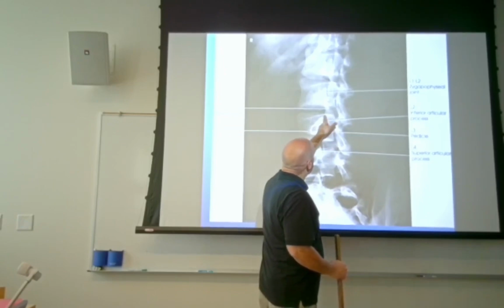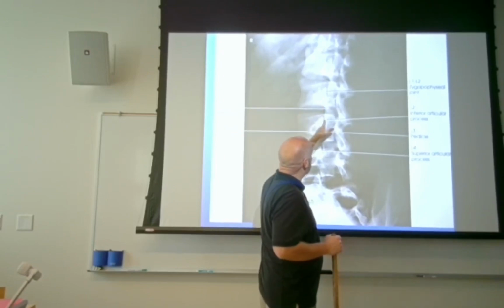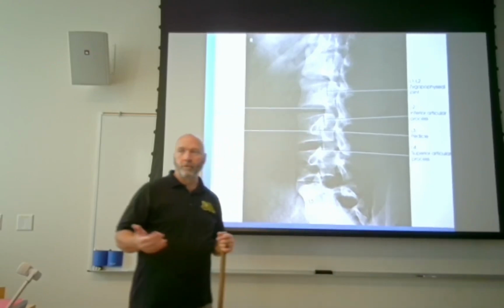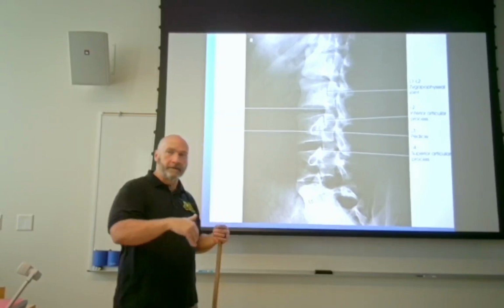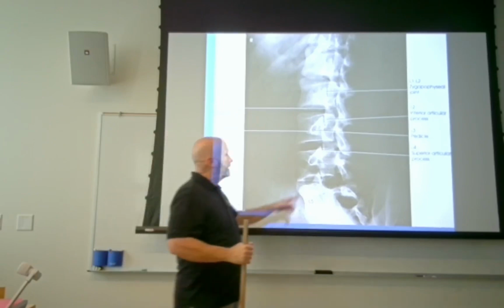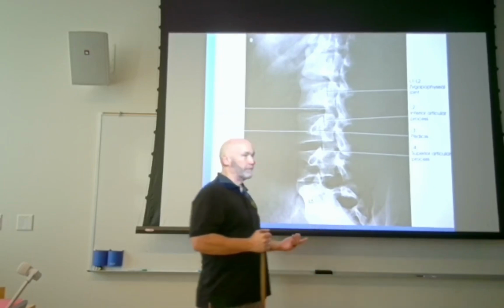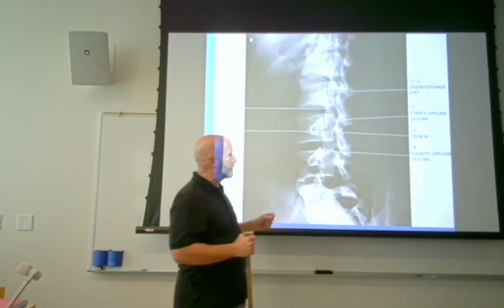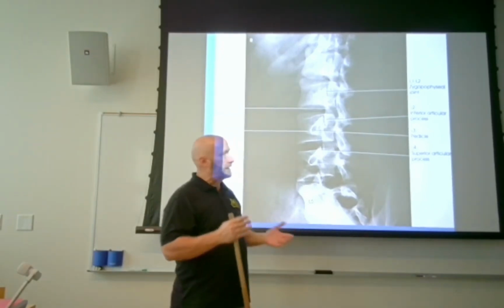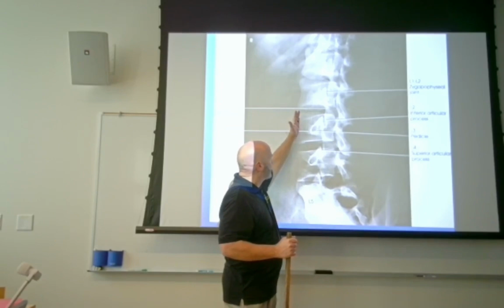But look what happens with the ear and the leg of this Scotty dog. You can kind of see that gap right there. That's your zygapophyseal joint. So the zygapophyseal joint is formed by the leg of the vertebra above and the ear of the vertebra below. And it's that dark line that we're seeing there. The rest of the Scotty dog, I won't say is completely irrelevant, but those are the main parts to it, and the way that you determine whether or not you've got good rotation is where is the nose of the Scotty dog? It should be right at the edge of the vertebra.